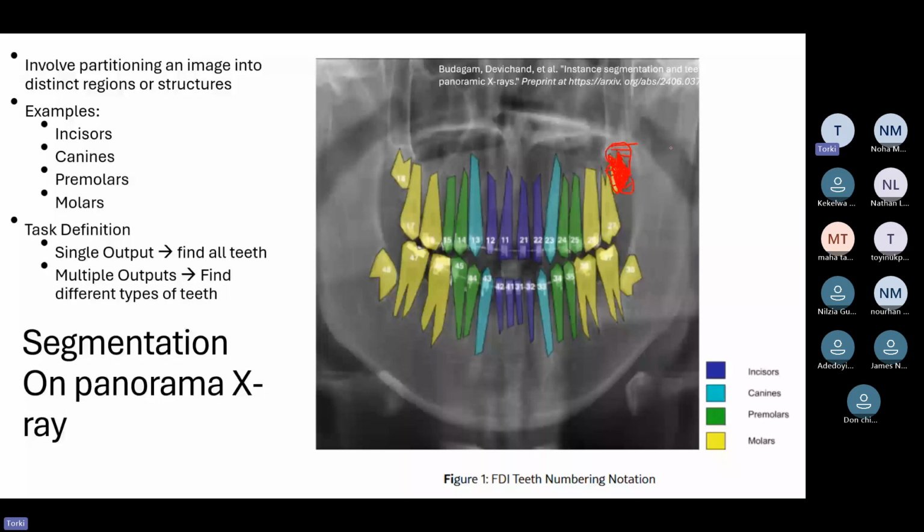Yes. So the ones that I correctly captured are called the true positives. So the overlapped region is called the true positive, because I predicted correctly and I predicted them as the positive class, right? Yes. And the outer region here is called false positive. I assume they are positive, but they are not positive. And this one on the left is called false negative.